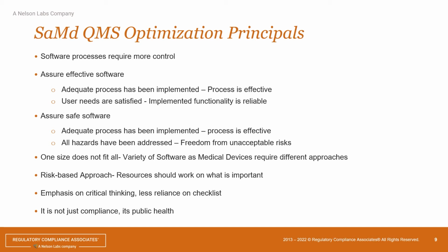Optimizing basically is a streamlining, and when we're trying to streamline, we just got to remember what are the key factors that we got to keep in mind. And software, because its development cycles are quicker, because we could do mass deployment, etc., we have to have more control, or we have to have a better way. That's why when you look at the regulators, there are a lot more standards about how to do software, like the IEC 62304, the TIR 45, etc., on the software side as opposed to the hardware side, because it's much easier to make changes and then go out in the field.